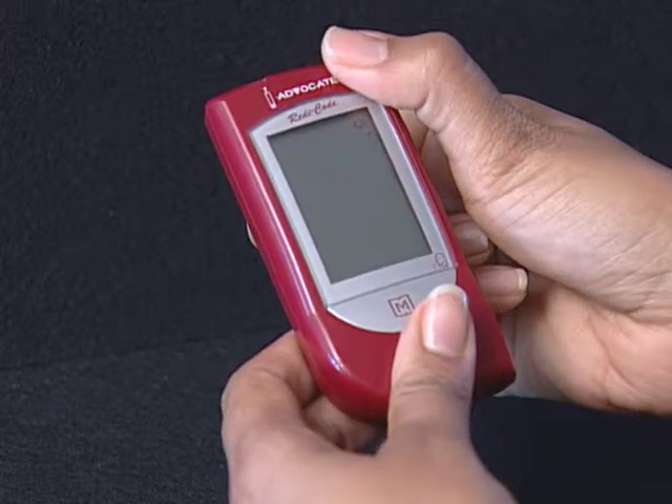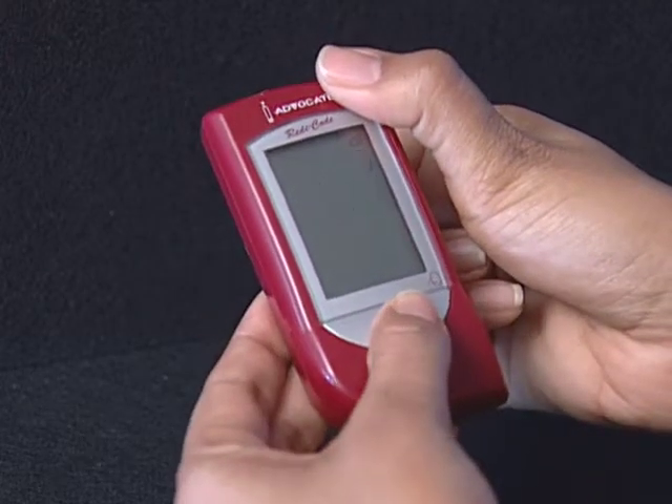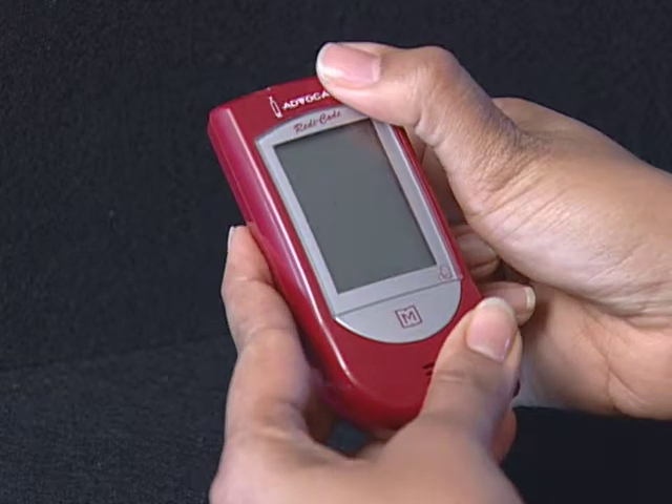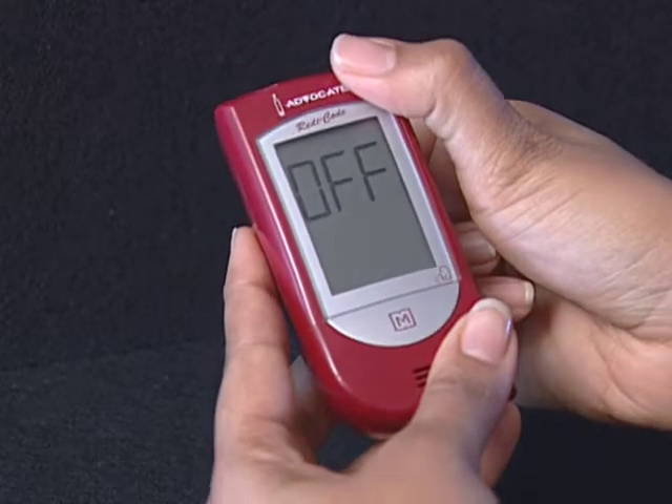Step 10: Select language. Press the M button to select. L1 is for English and L2 is for Spanish. The setting mode is all completed. Press the Set button to turn off the meter. Off is displayed before shutdown.